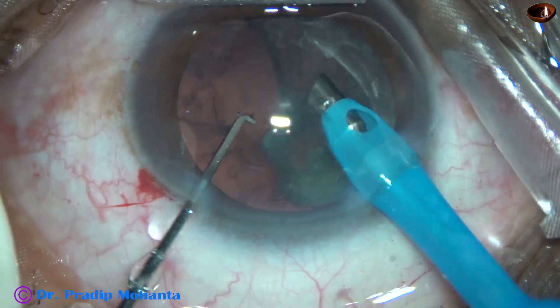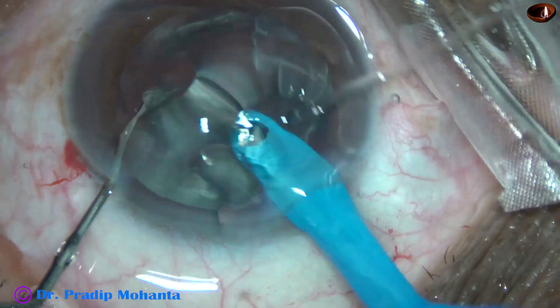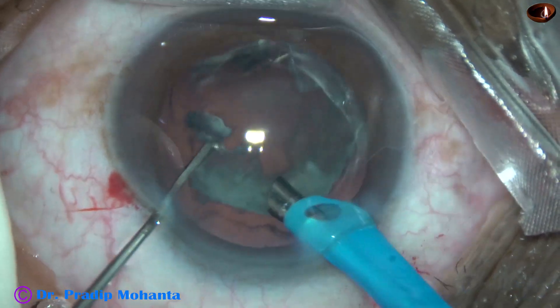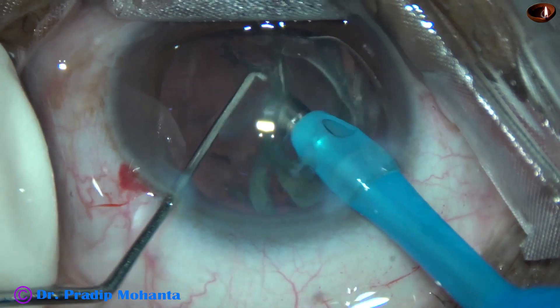And now I am in feco 3 mode when the vacuum is less, about 200 at this time. During nucleus chopping and emulsification, the vacuum was 450, and now it is 220.